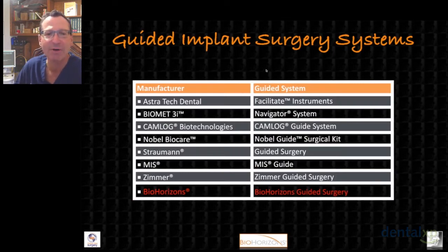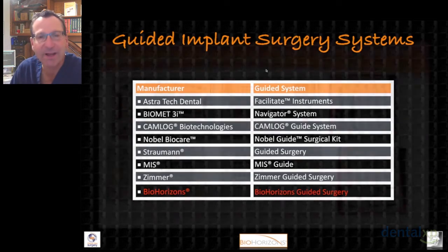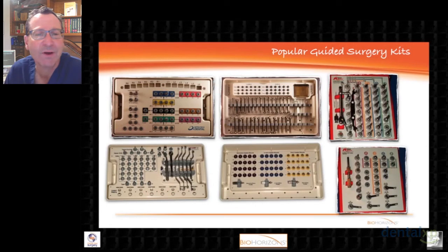There are a number of guided implant surgery systems on the market, and so whatever implant system you're used to using, there is probably a fully guided or a partially guided kit that goes along with that surgical system. Now, I was involved in the development of the BioHorizons guided implant kit, which was released on the market earlier this year.